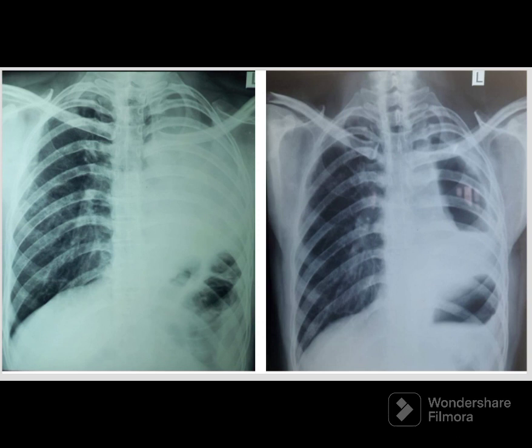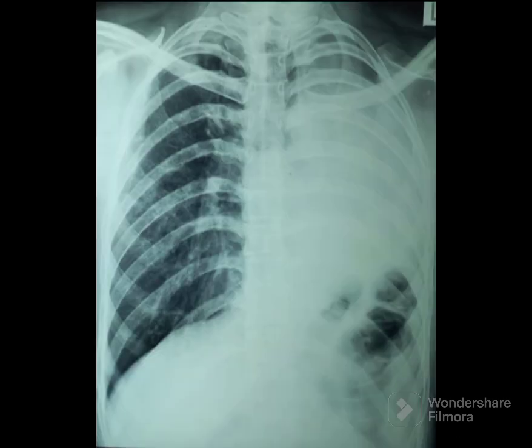Let us examine the first chest X-ray. There is complete whiteout of the left hemithorax. The left diaphragm is elevated. The right lung is hyperinflated. The trachea is shifted to the left. If you note carefully, the rib spaces on the left side are slightly narrowed compared to the right. Now let us take one single finding — complete whiteout of the left hemithorax — and see all possible causes.